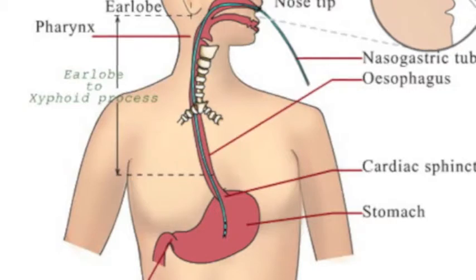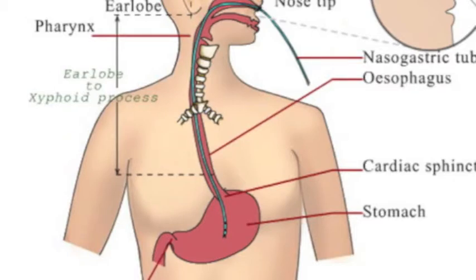If you know that this person's abdomen is rigid and they're nauseated, it's decompression. If someone comes in after an MVA and the abdomen is rigid, and the physician says to instill normal saline, that's a lavage.